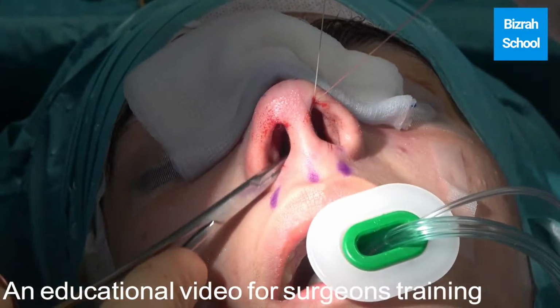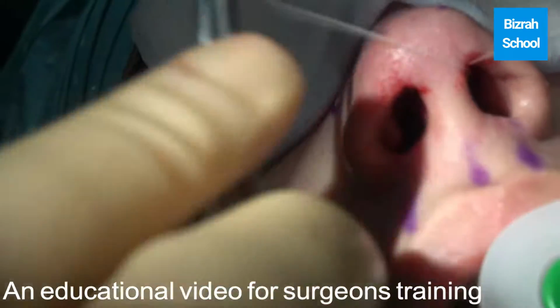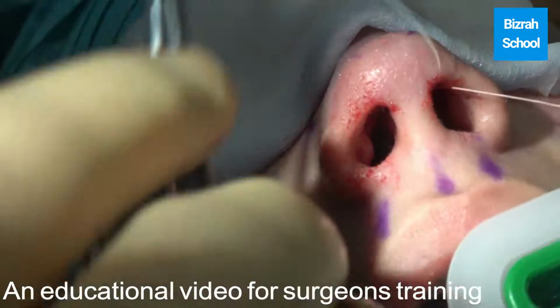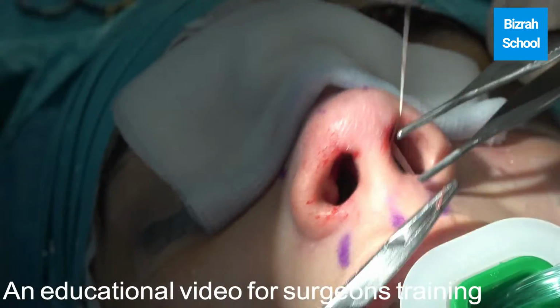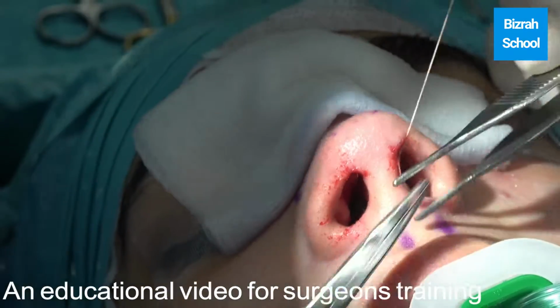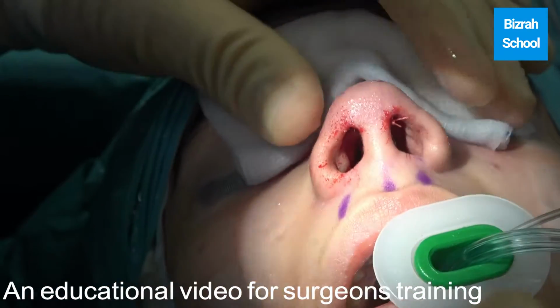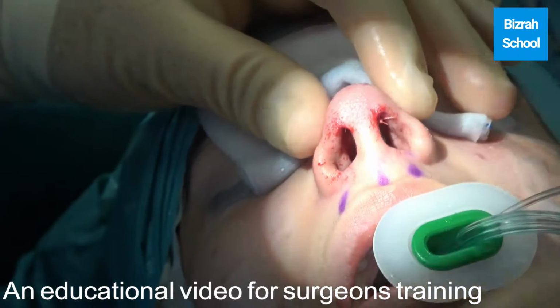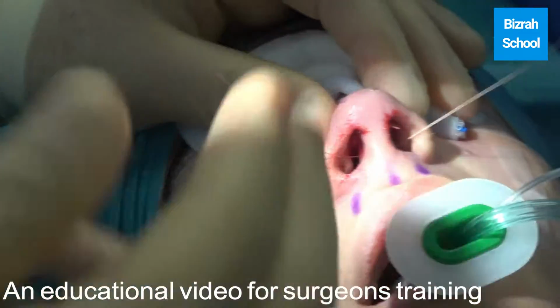You see now, very nice there, very nice inside. Okay. Again. Okay. One more suture to secure.